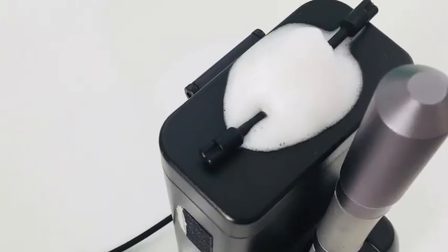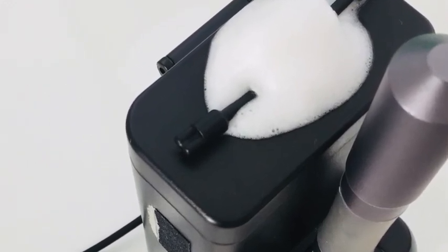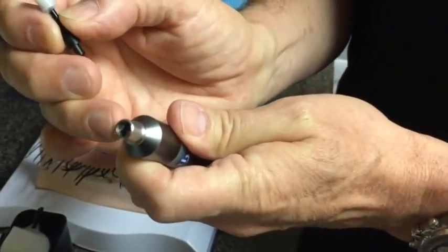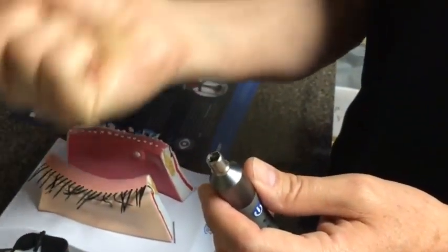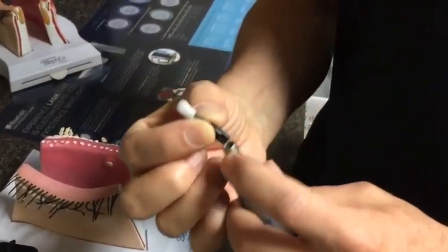Now you'll take one of your completely soaked tips for your first eye and note that it has a double barrel design on the base. Little double barrel design. Well, that matches that double barrel design in the chuck. So it really only fits in one way. And you just simply take the chuck. I like to take it in my dominant hand, my right hand, and hold the handpiece in my left hand. I just think it's easier to load that way.